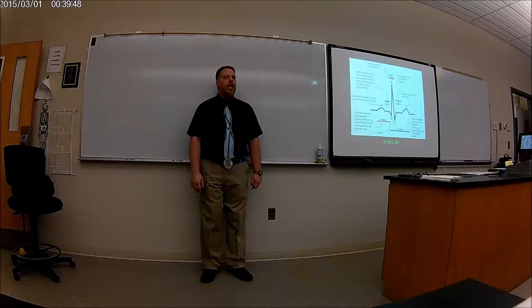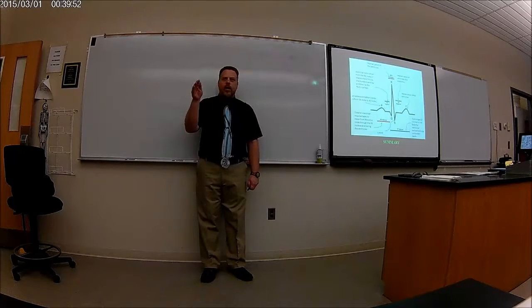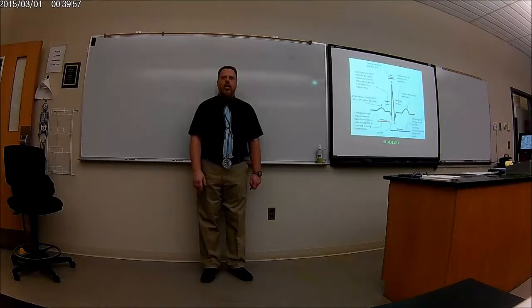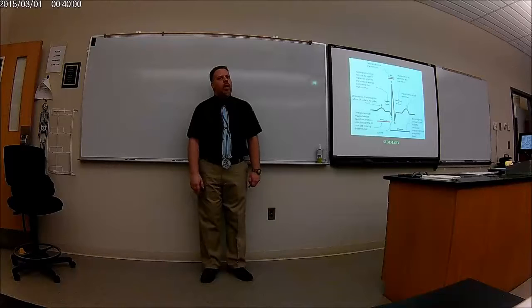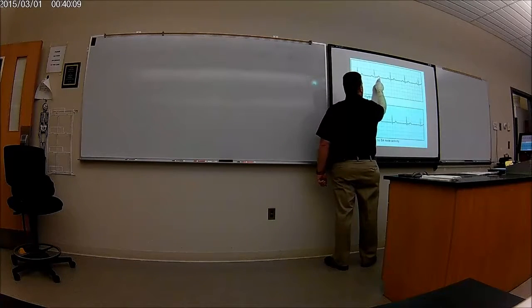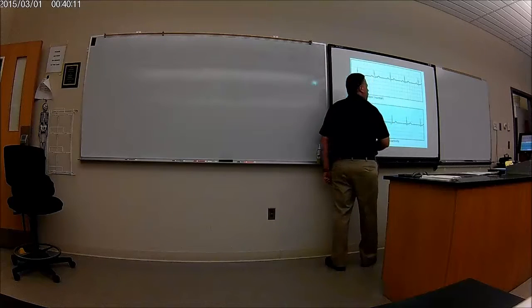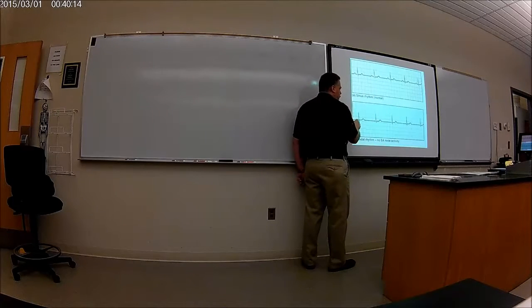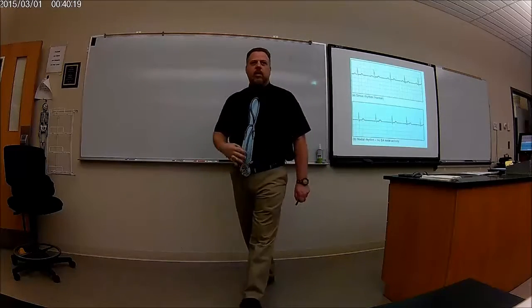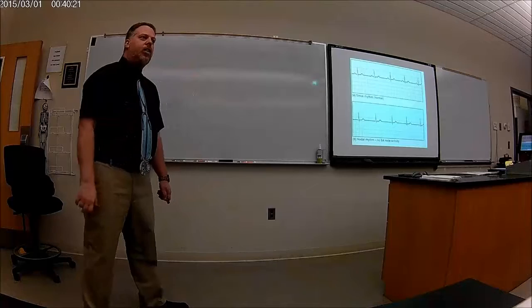The atria are not contracting. What makes the atria contract of that electricity? SA node, AV node, that whole thing. The SA node. So if there is no P wave, then the SA node's not firing. Does that make sense? So this is what normally, here's the PQRS-T. PQRS-T. Look at this. No P. You have a QRS-T, QRS-T. You see? You're getting to read EKGs now.